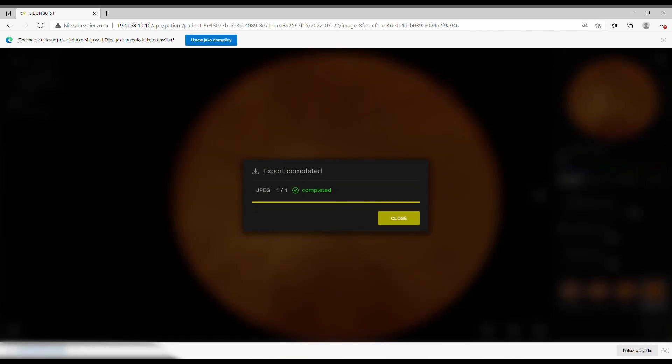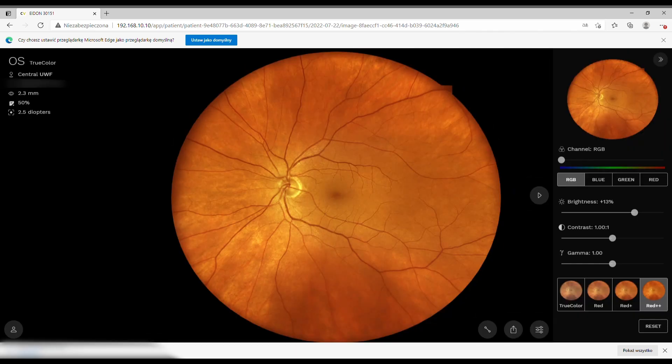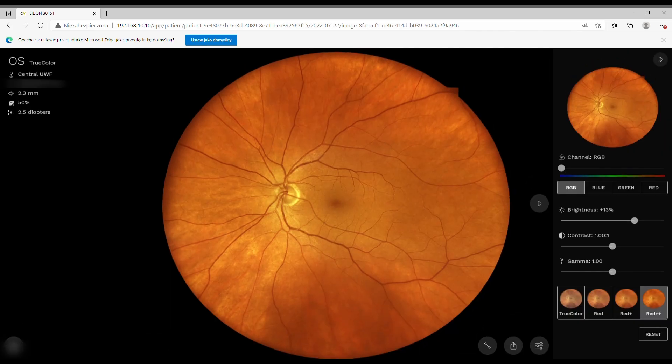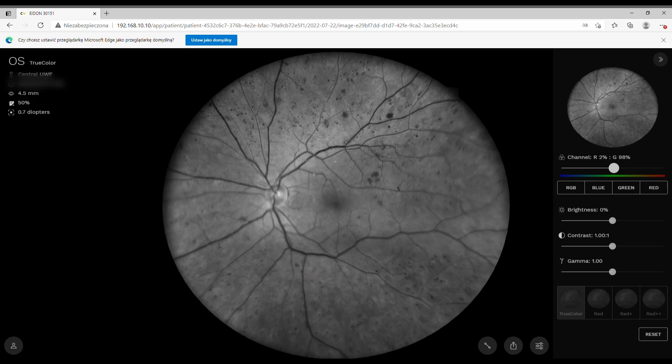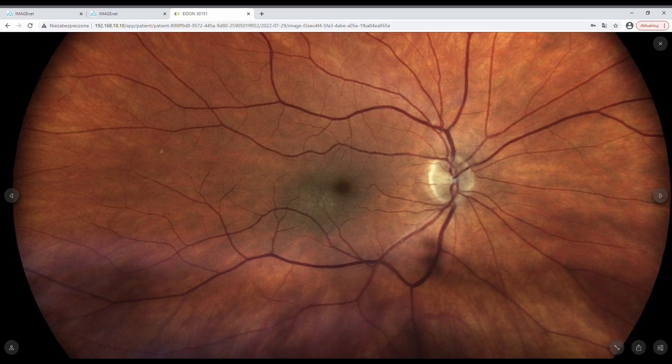You can send images to the printer or download them. Note that the downloaded images are not anonymized. By the way, the pupil diameter in this case was 2.3 millimeters. For another patient, you can change filters to get a nicer reddish view of the retina. Red Plus Plus is slightly too much — I usually use Red Plus.